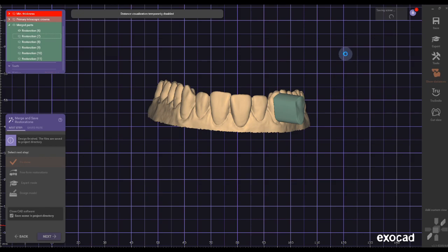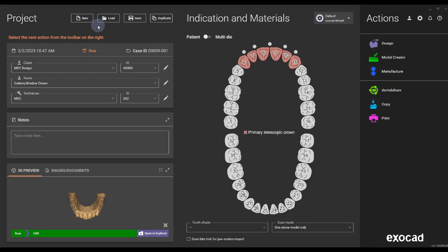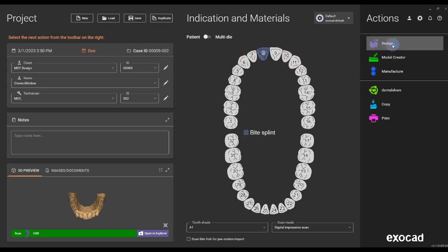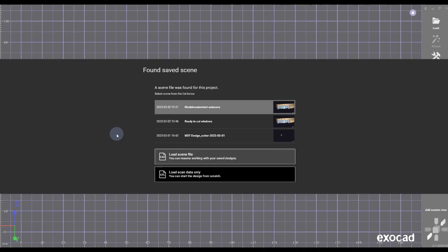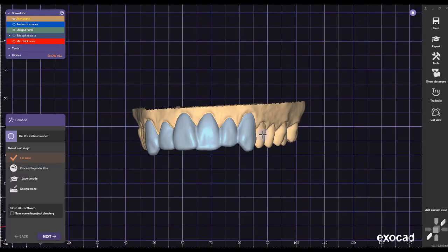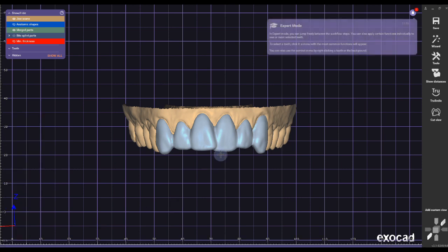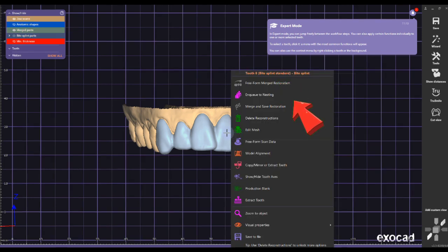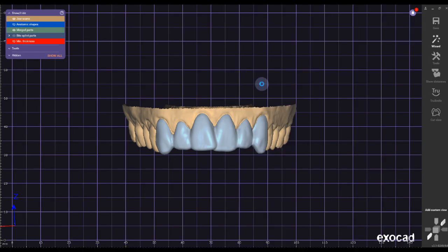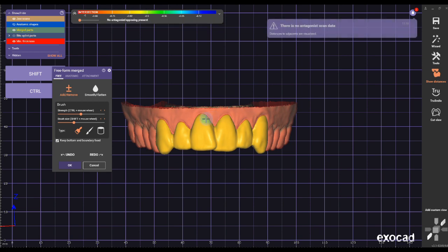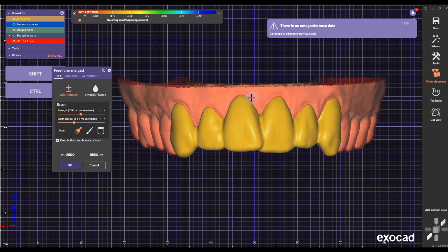Once you get to number six, load your original night guard or bite splint case and click on Design. Go to 'Ready to Cut Window' — the scene we saved earlier. It will load the scene. Go to Expert mode, make sure everything is merged — it only works if the whole thing is merged. Go to Freeform Merged Restoration; it doesn't work in the regular Freeform step.